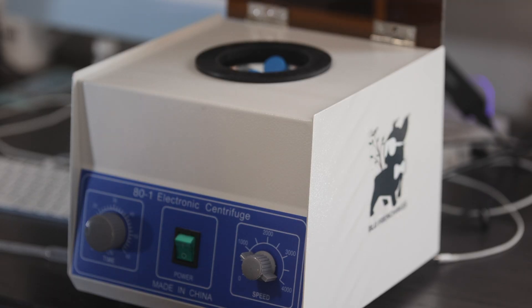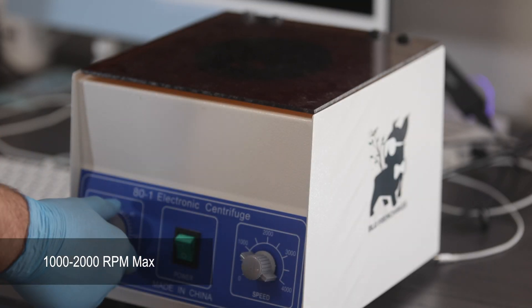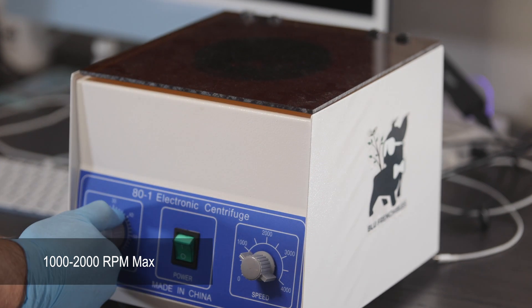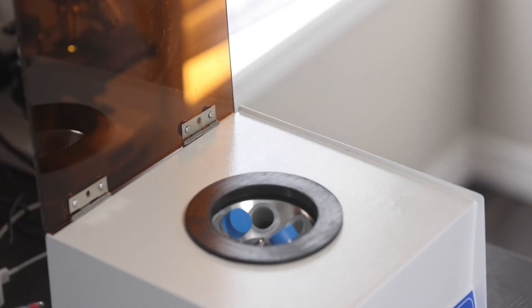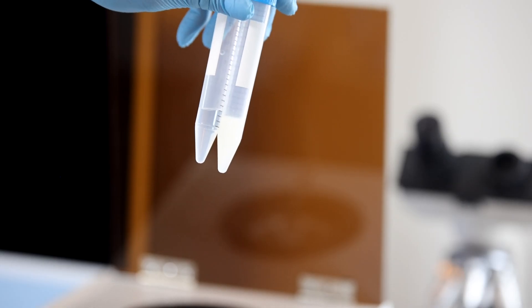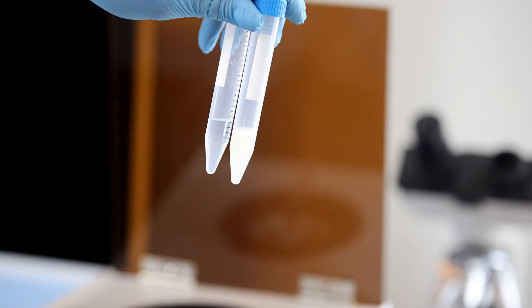With your verified sample collected, you'll want to insert it into the centrifuge machine and spin it at a low speed for about 5 minutes. We'll set our machine to 1000 RPM and remember to balance the machine by placing another centrifuge tube with an equal volume to your collection on the opposite side of the centrifuge.